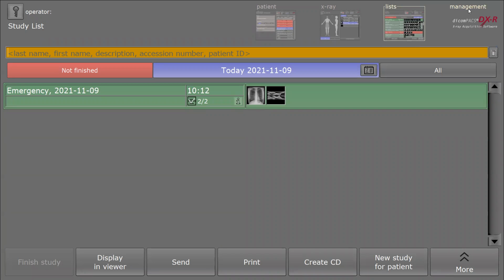And as you know, this is the first year we are providing your X-ray units in Vietnam. So there will be many problems and errors. We need you to come back to us and support us.